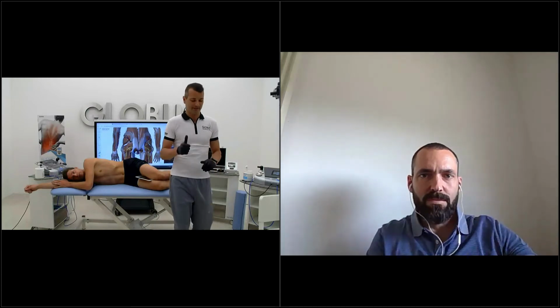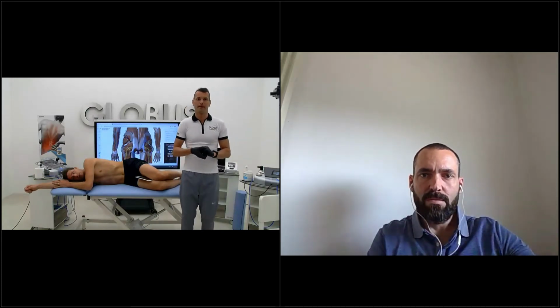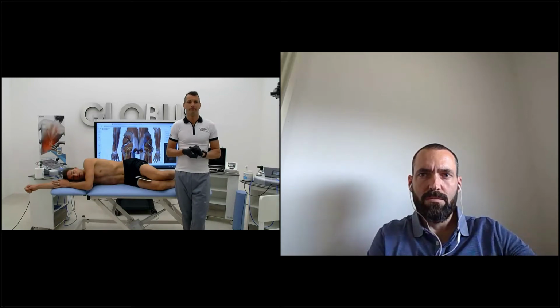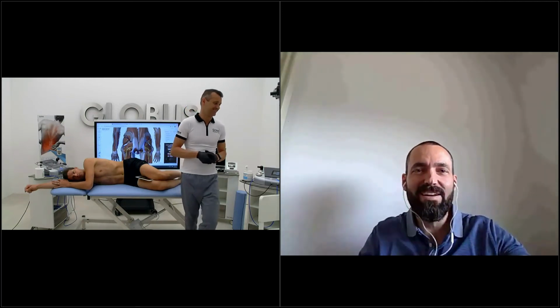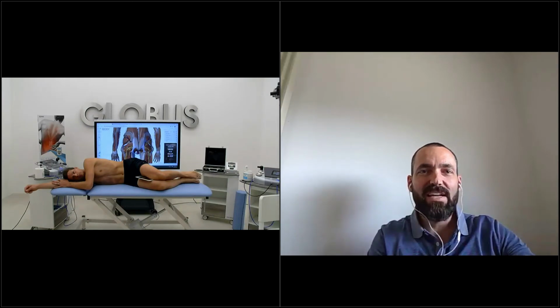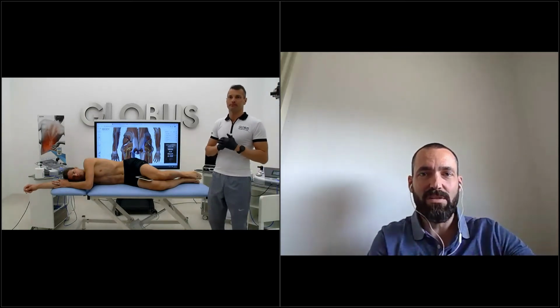You're right. Great. There is a question, Enrico, about how many sessions of treatment with that fascia tool we have to do to get a good result. Can you answer? It depends. He already had a good result in 10 minutes of treatment. Of course, in this case, he will probably need to repeat it the next day or in 2 days. But it depends on the case; you can have immediately good results.